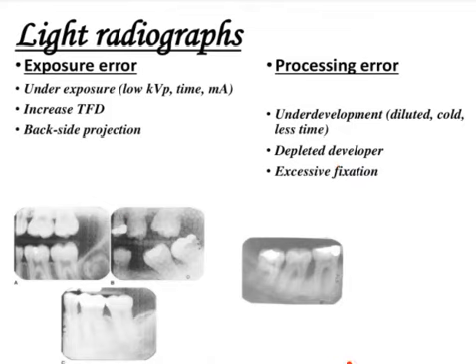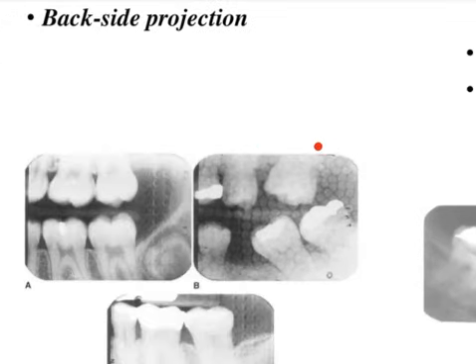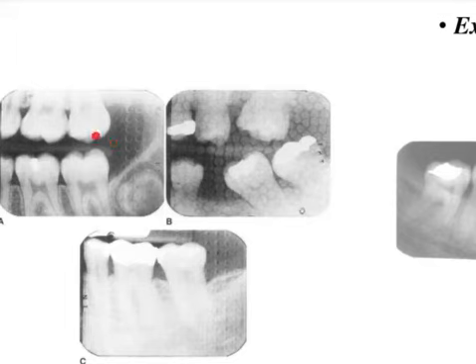This is the tire track appearance, okay? So you can clearly see the difference between both of them. The one that you see on the left and below, these are called tire track appearance. You will see this print or design only on two sides, one and on the other side.